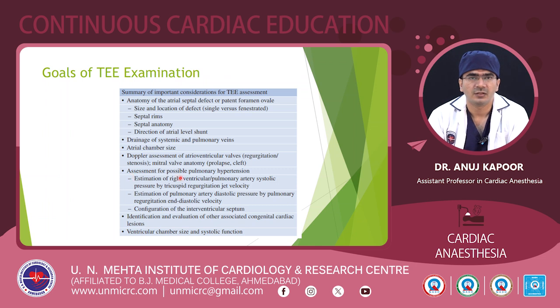And assessment for possible pulmonary hypertension: estimation of the right ventricular and pulmonary artery systolic pressure through the TR jet, and estimation of the pulmonary artery diastolic pressure by pulmonary regurgitation and diastolic velocity.